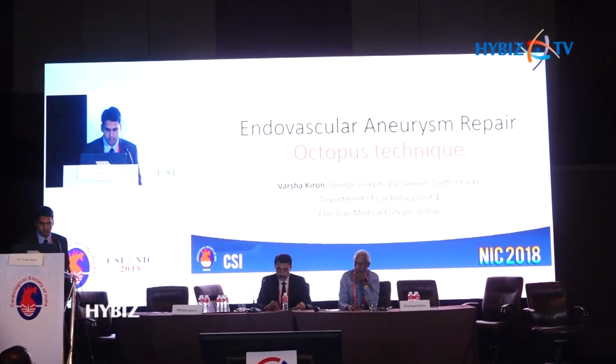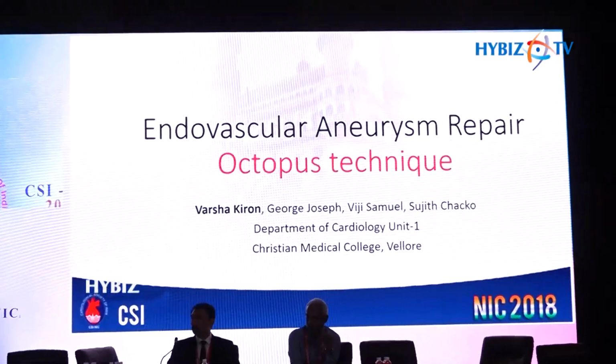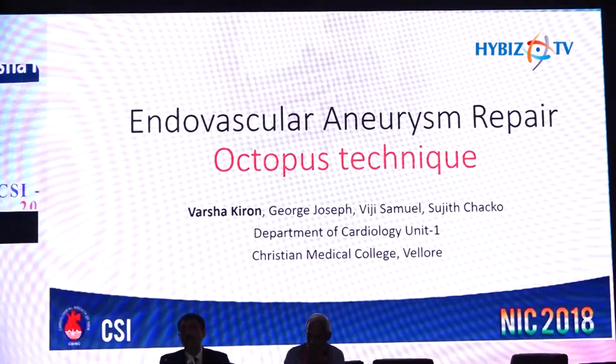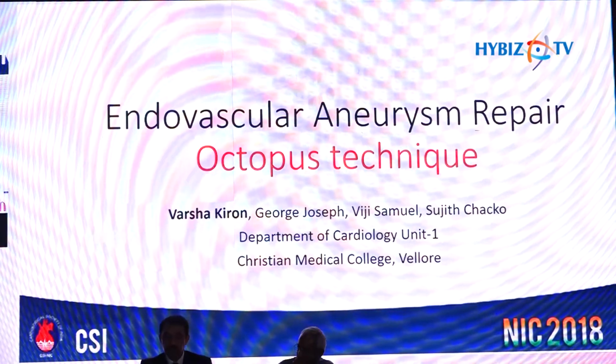Good afternoon, everyone. I'll be presenting a complex endovascular aneurysm repair, which was carried out by the Octopus Technique in our institution. We have probably done around 5 cases in the last 1.5 years. This was the most complex of all.